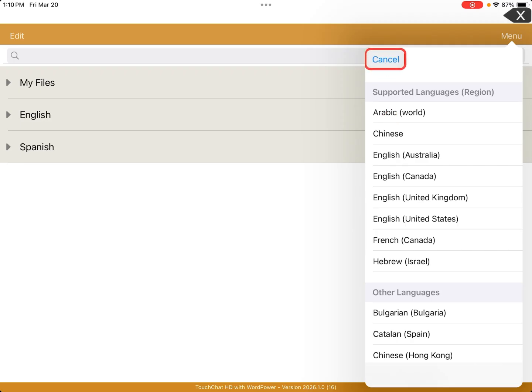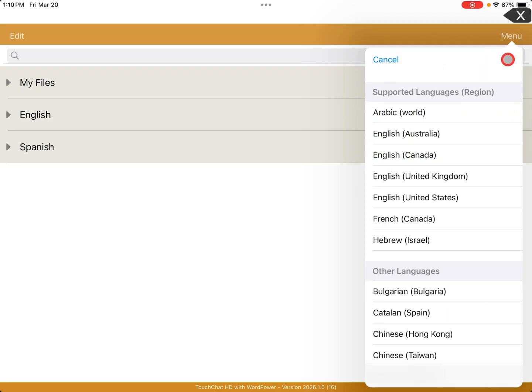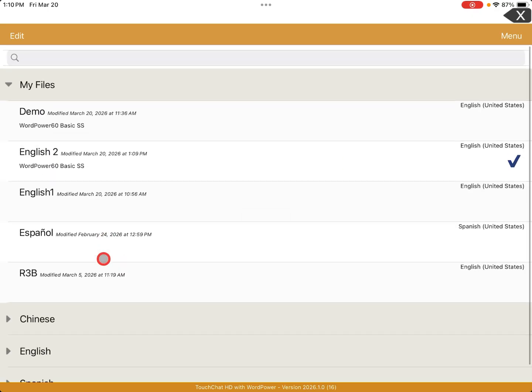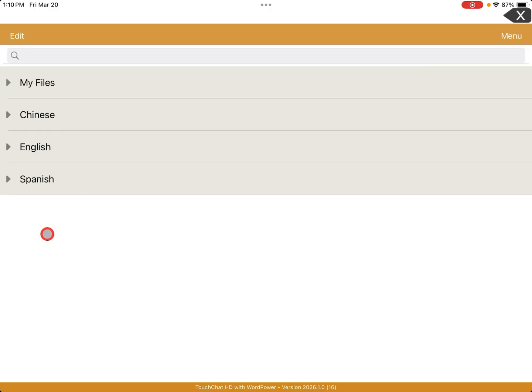So I would click on it. I'll do Chinese so that I can see. Click OK. And that's it. And I can say, we're done. And I'll load, and it will load it so I have all the languages. The majority of the time we do Spanish, so I'll show you what I do in Spanish.